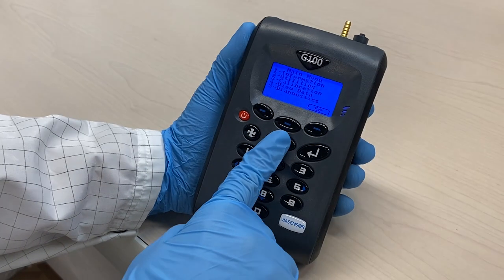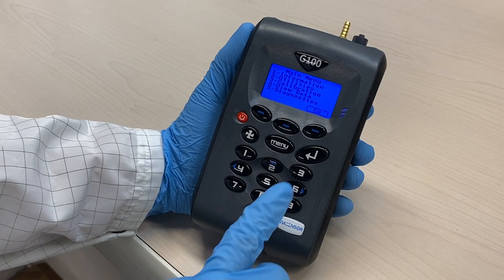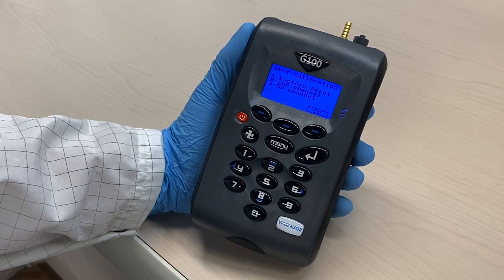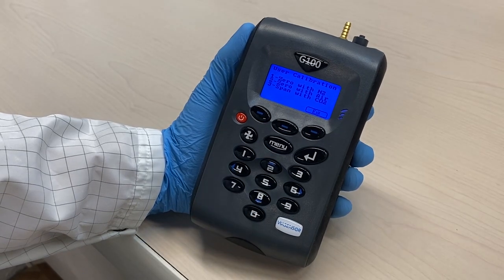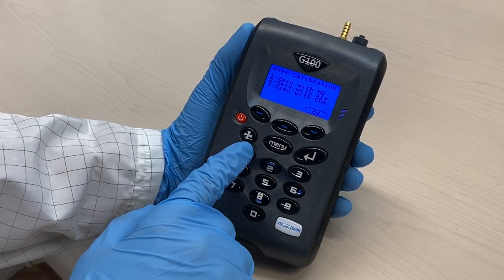Press the menu key. Choose 3 for calibration, then select 2 for the CO2 channel. Press 1 for zero with nitrogen.